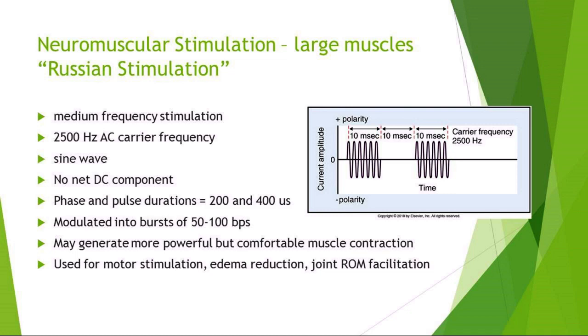Those are like the 2 most stimulated muscle groups if you look at the different studies, because quadriceps inhibition is really common after knee surgery, and knee surgery is really common. So we're doing that a lot in PT. If we're going to be stimming anything, we're going to be stimming that. Also, drop foot is really common, whether after orthopedic surgery or a stroke or something like that. And so we're using muscle stim a lot for dorsiflexion.